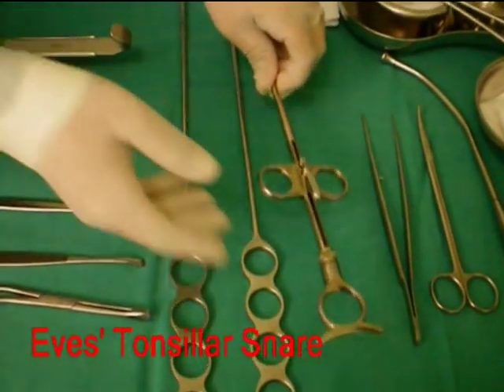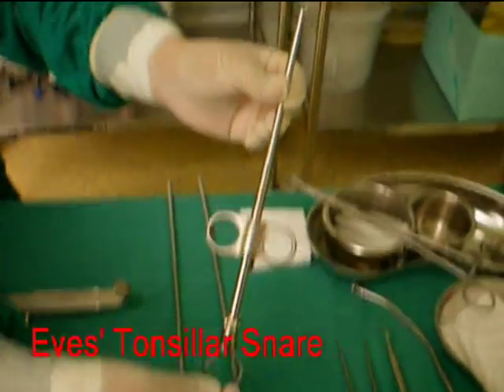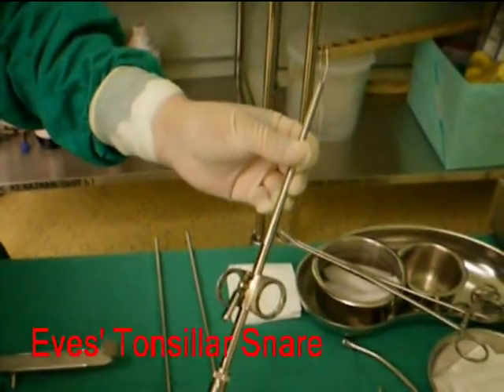An Eves' tonsillar snare is used to crush and snare the inferior pedicle of the tonsil, when most of the tonsil has been dissected away.